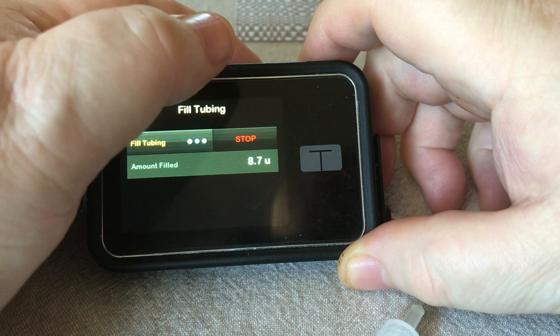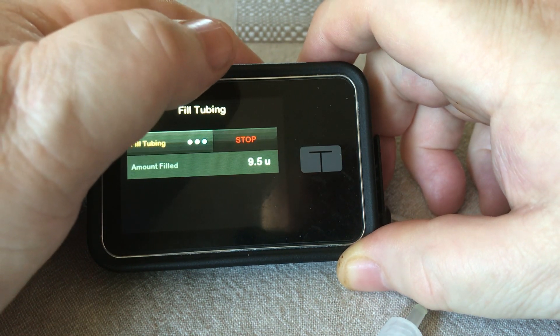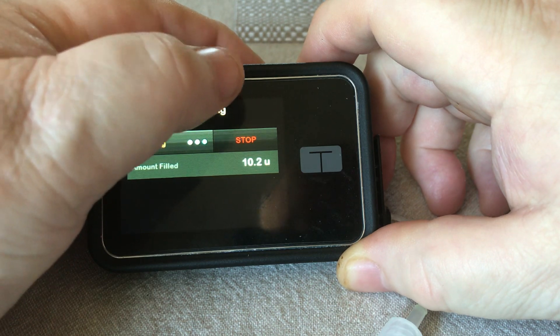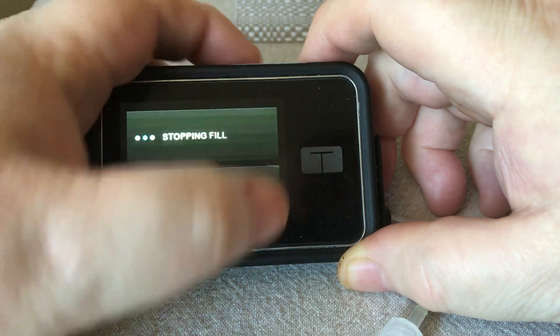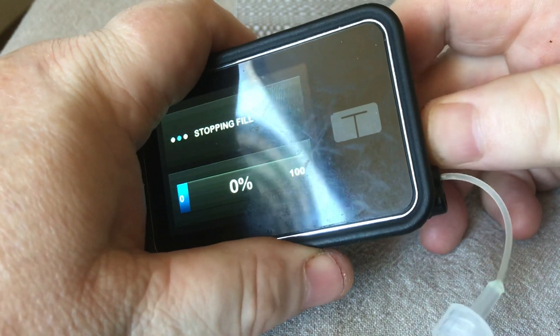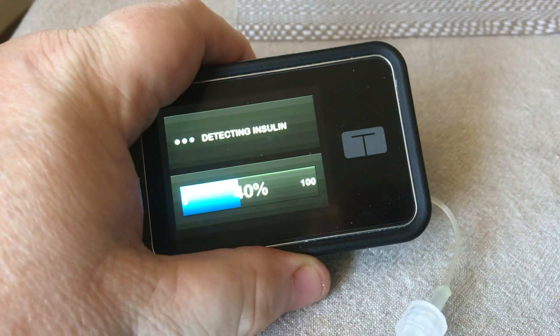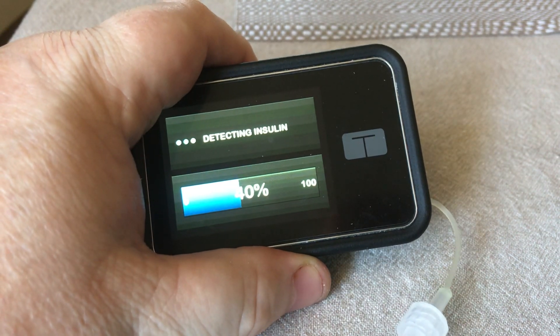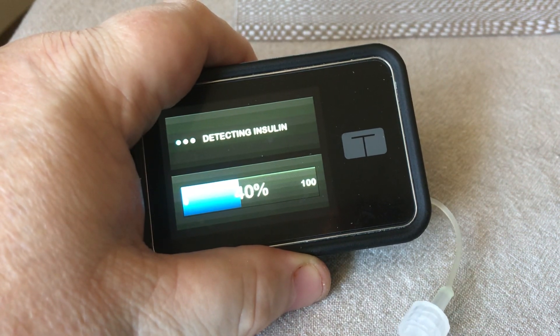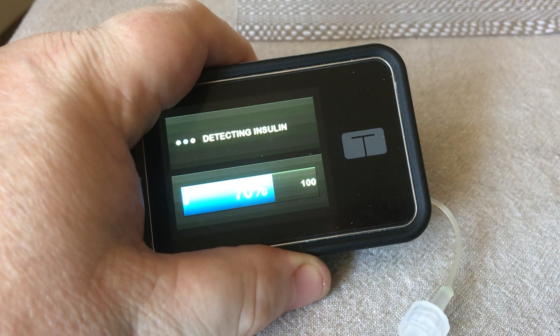Almost there. Hope everyone's having a nice day and your levels are behaving. Okay, we've gone over 10 — I press stop. Whilst it says 'stopping fill', which goes for about five seconds, I now push it back into place. During this 'detecting insulin' phase, it will deliver one cycle of the micro delivery system, which is, I believe, about 0.36 of a unit.